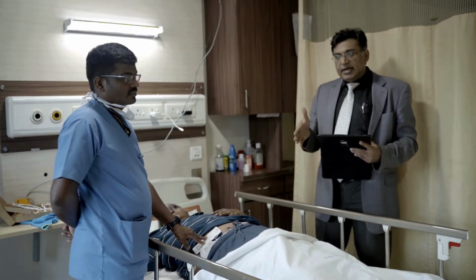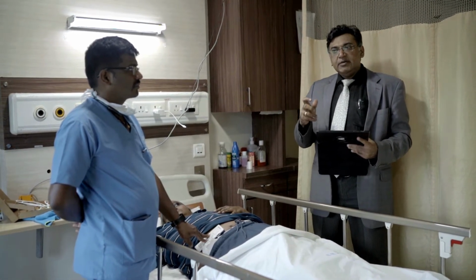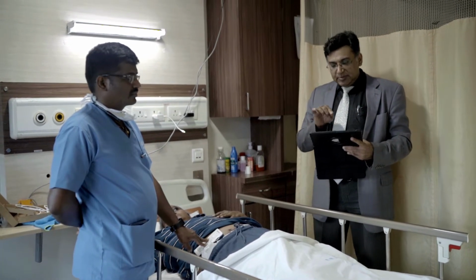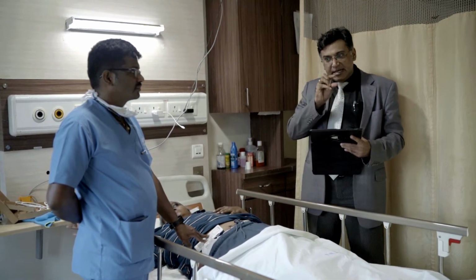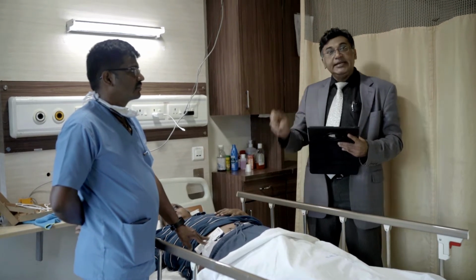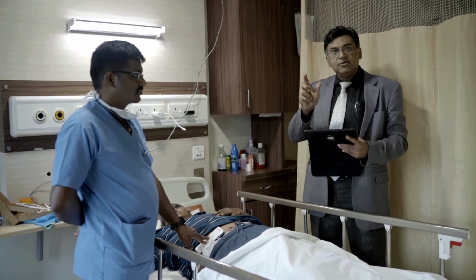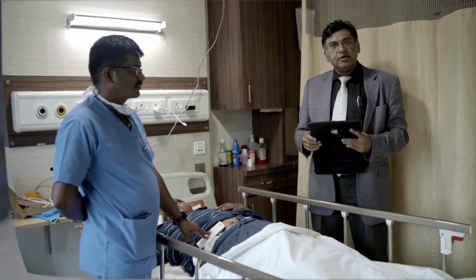From 9 o'clock in the night till 5 o'clock in the morning, she has some problems specific to that time, which involve tightness of the leg, a lot of pain in the leg, and difficulty in turning in bed. The pump is designed in such a way that I can give additional doses at that particular point of time as per the patient's need. So what I have done today is a flexi program where I can give extra doses at the times that she needs it, so that she is as comfortable as possible around the 24 hours.